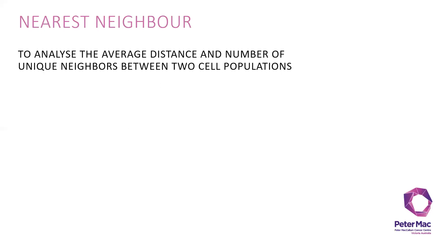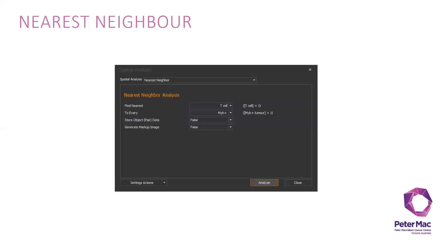First, nearest neighbor. You use it to analyze the average distance and number of unique neighbors between two cell populations. For example, here I would like to find the nearest T cells to every Myb-positive cell. On HALO, it allows you to store each individual data, showing the individual distance data or the markup image on your image.